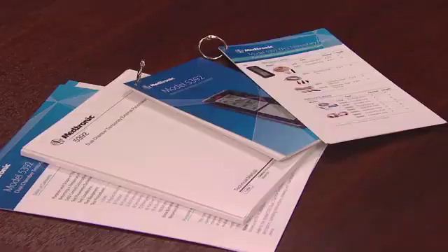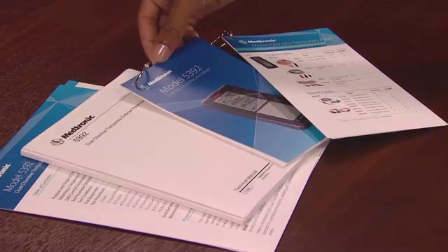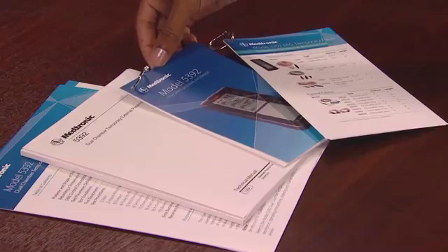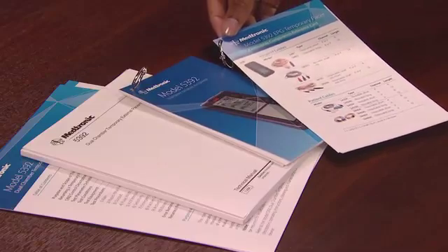Before we start, I want to mention two additional resources available for users of the 5392. First, we have the 5392 Quick Reference Tip Card that describes basic operation of the 5392. Second, we have the Compatibility Guide that lists all compatible leads and accessories.